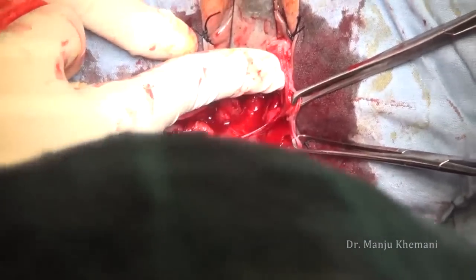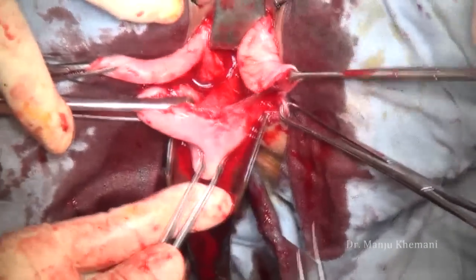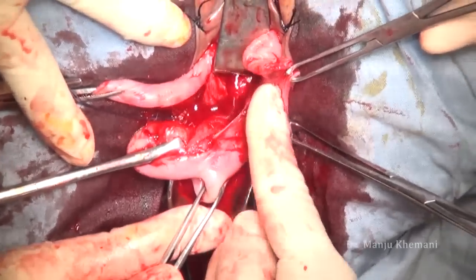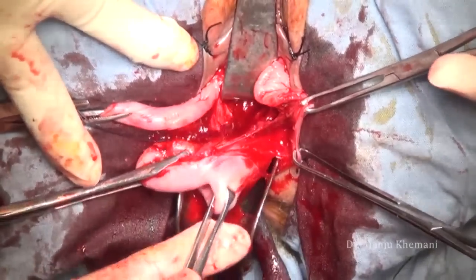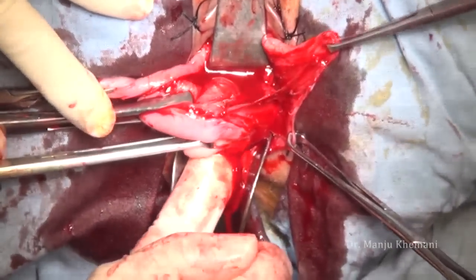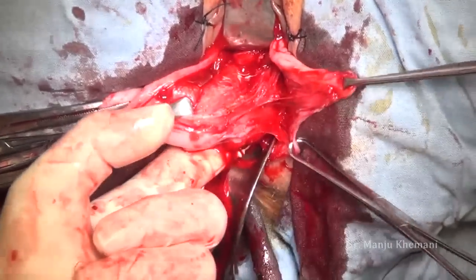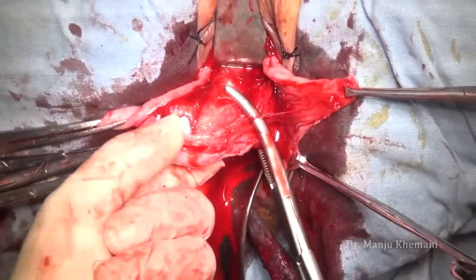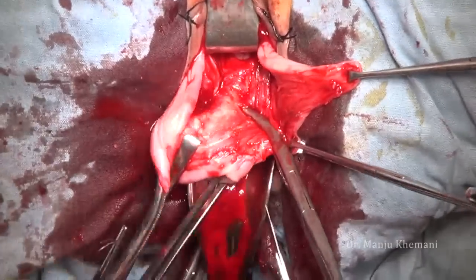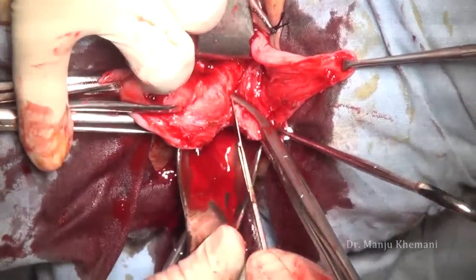There is a small bleeder — we cauterize it. Now again my finger has gone back to hook the uterosacral ligament so that it comes into the clamp. Take a good Heaney clamp and take your first clamp, which includes the uterosacral and cardinal ligament. Cut it so that enough tissue is left on the clamp side so that it does not slip.